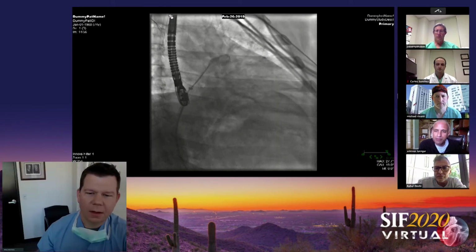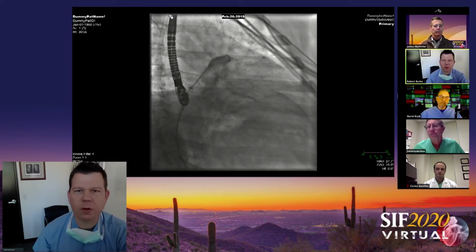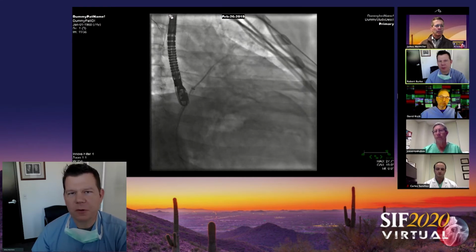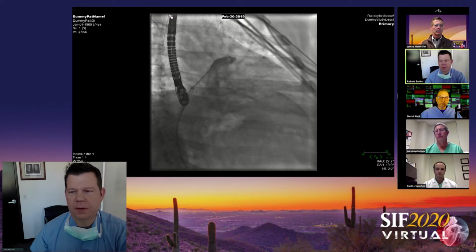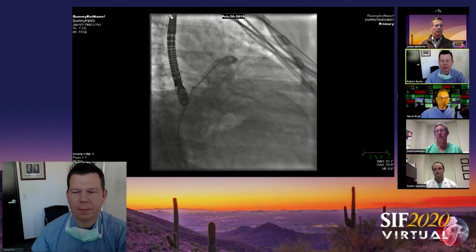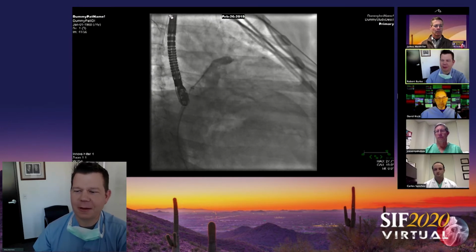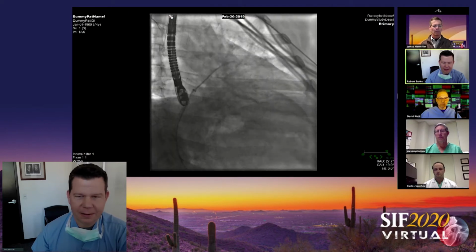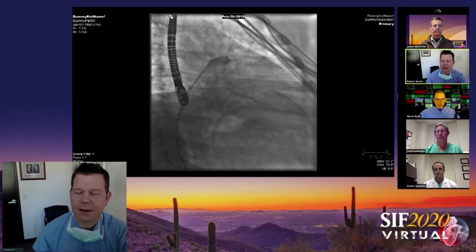What I would say on TE versus CT is that you're dealing with the traditional recommendation for Watchman imaging based on 2D planar imaging. That's always going to be a limitation, and that's problematic. We used to do that once upon a time for valve sizing for TAVR. Once upon a time, that was our go-to. You'd get an LVOT diameter, and that determined your valve size. We all know that is fraught with peril, invariably underestimates what size device you need.